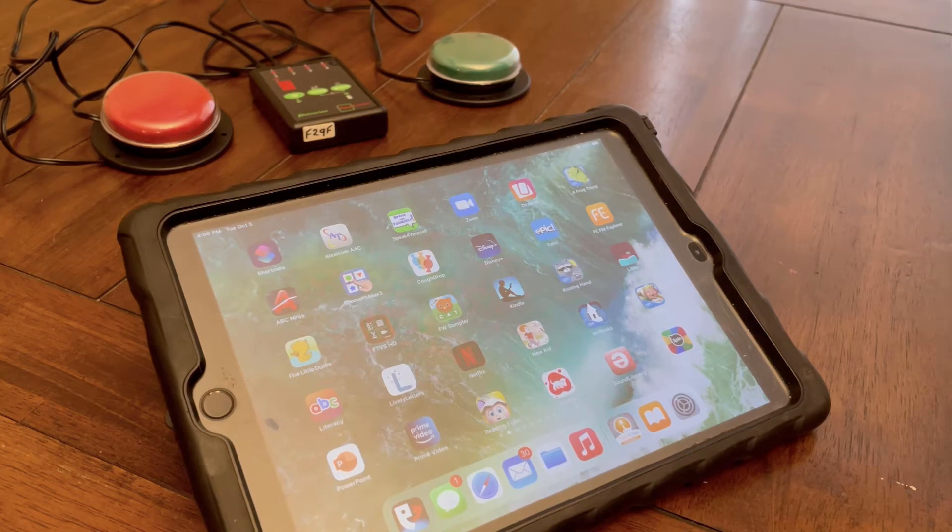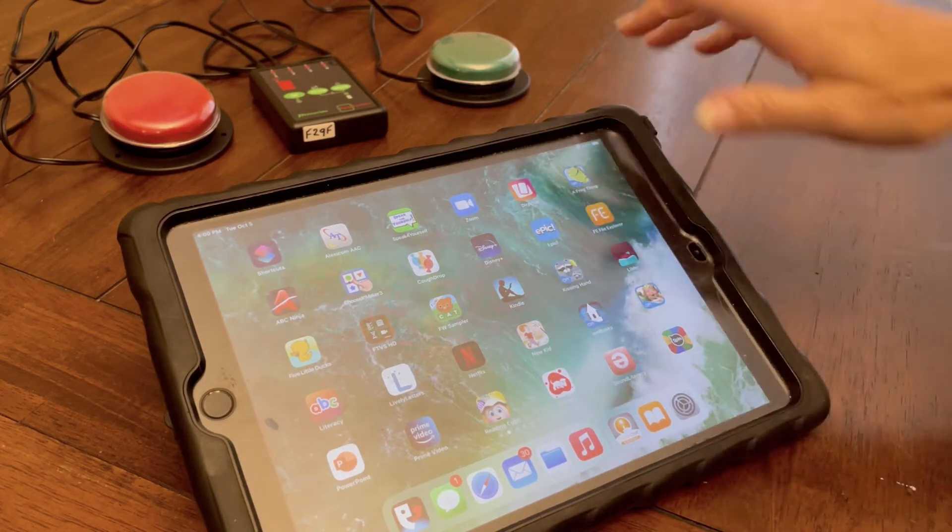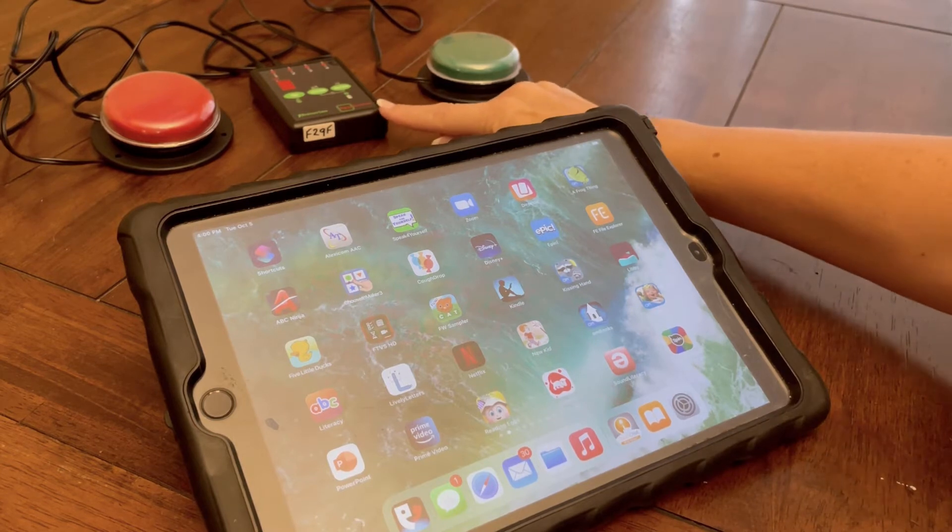This is just a quick video of how to set up switch access to the iPad. You'll need an iPad, a Bluetooth interface, and switches.